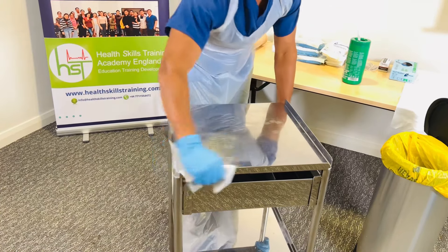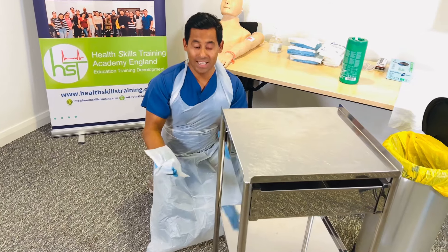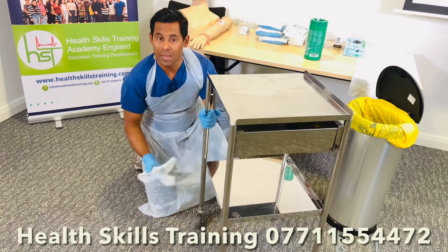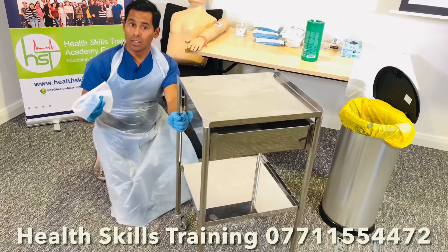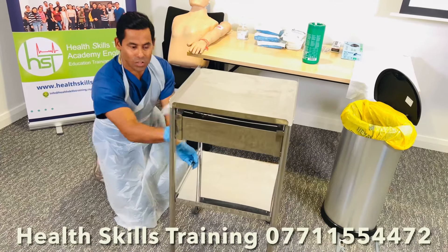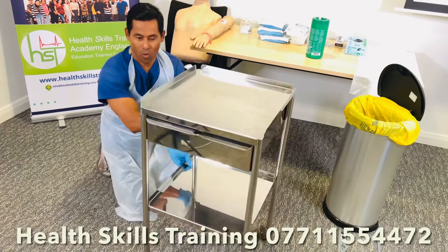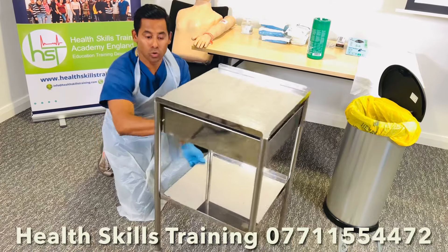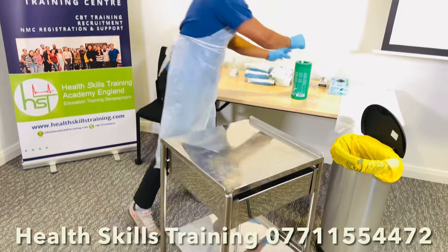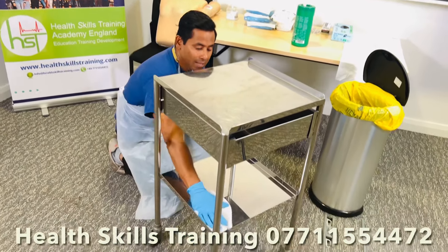Clean the sides of the trolley if it has side rails. A common error is cleaning the sidebar and then immediately holding the bar — please avoid that. Clean the sidebar, then rotate the trolley and clean. Make sure the wipe is completely open. Once you've cleaned an area, do not touch it again. Discard the wipe, use a fresh one if required, and then clean the bottom shelf the same way as the top shelf.